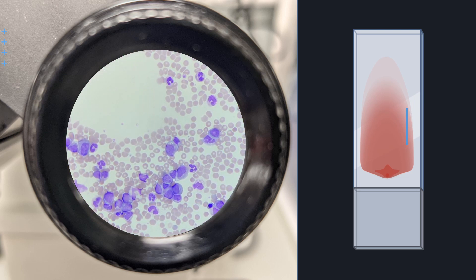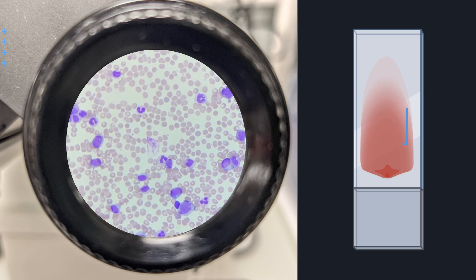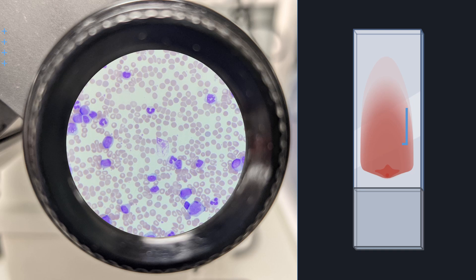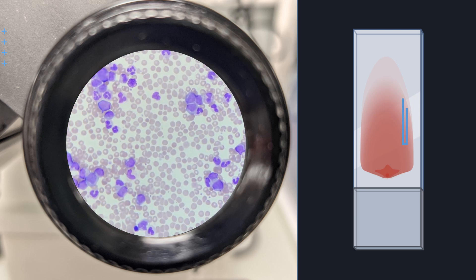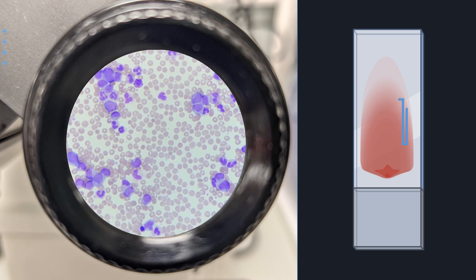Continue to move along until the cells start overlapping and it becomes too thick. Go up a field and then travel in the opposite direction until it becomes too thin. This method compensates for uneven distribution between the tail and the body, but not the centre and the edge. So if the standard 100 cells are counted, only a small area of the blood film would be covered.